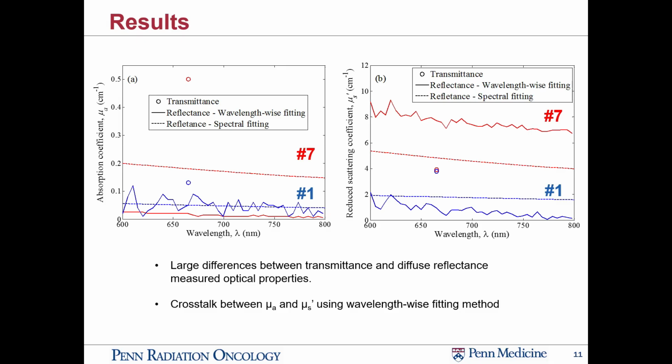If you look at it from the spectrum-wide result, this is the absorption coefficient as a function of wavelength plotted out. The dots are what is expected, which we know because we used some transmission spectroscopy at that wavelength, so we measured it.